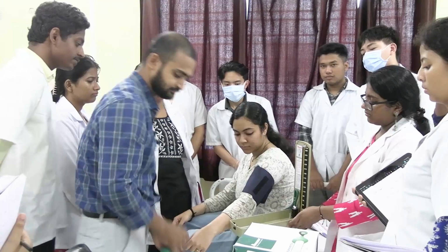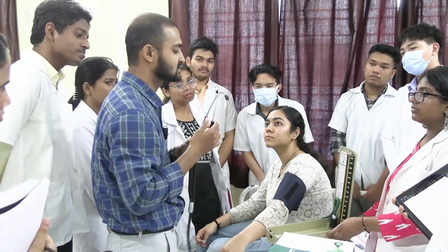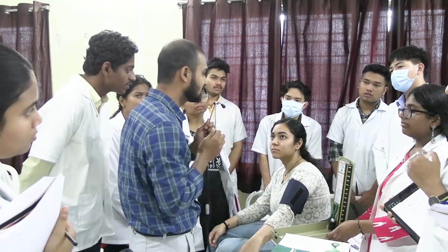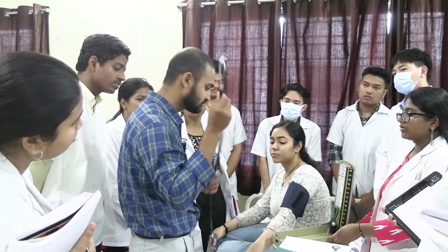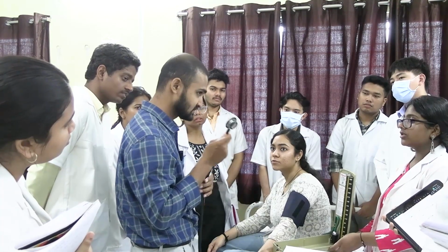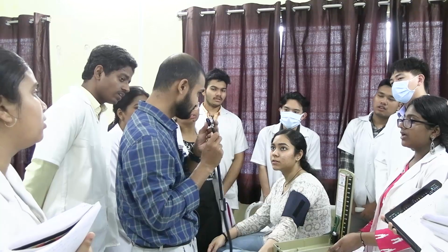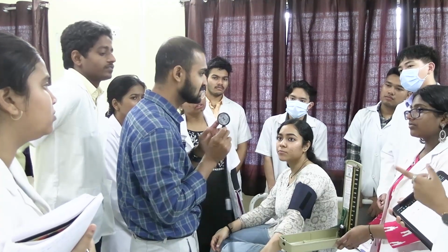Now what are the parts of this? A quick revision. This is the earpiece of the ear knobs. This is the metallic tube. This is the Y-shaped tube. And the rubber tube. This is the chest piece. This is the diaphragm. This is the bell.